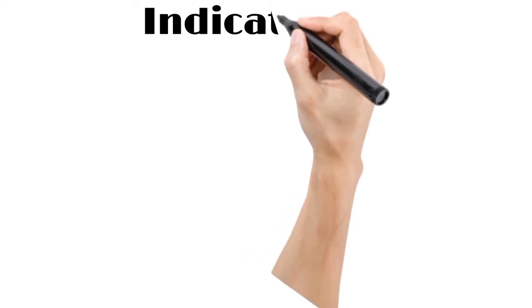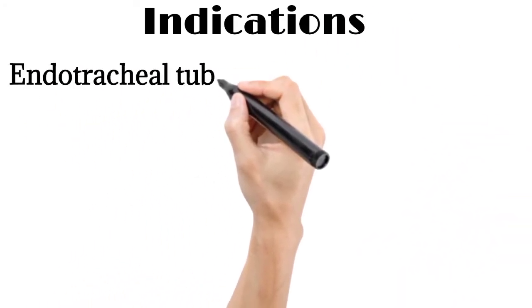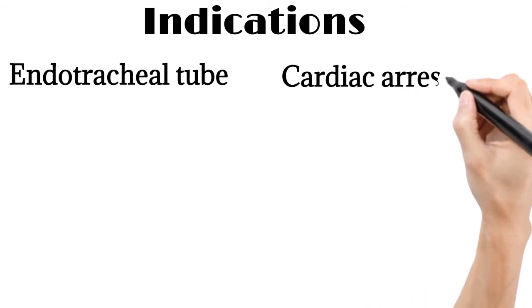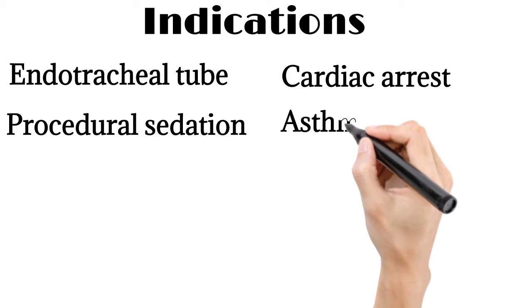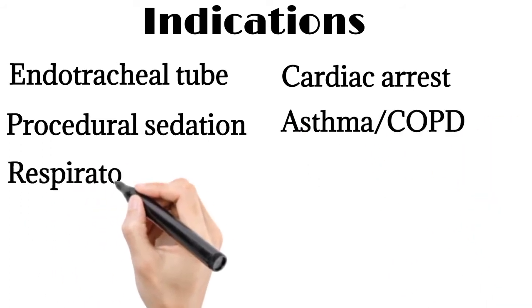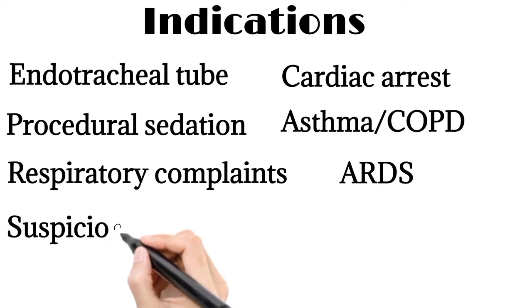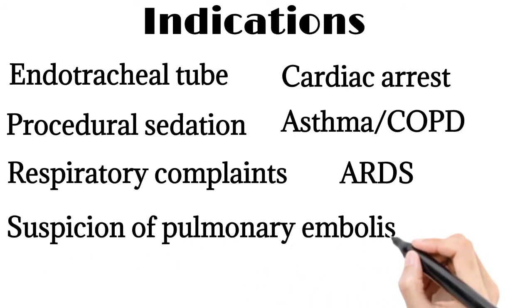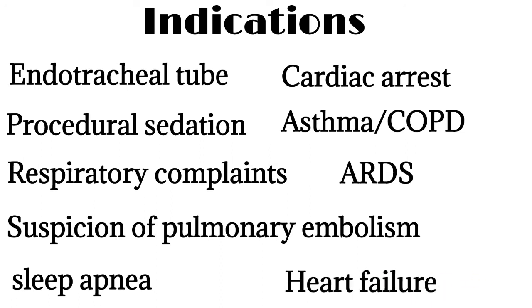Indications: endotracheal tube, cardiac arrest, procedural sedation, asthma or chronic obstructive pulmonary disease, respiratory complaints, acute respiratory distress syndrome, suspicion of pulmonary embolism, sleep apnea, heart failure.